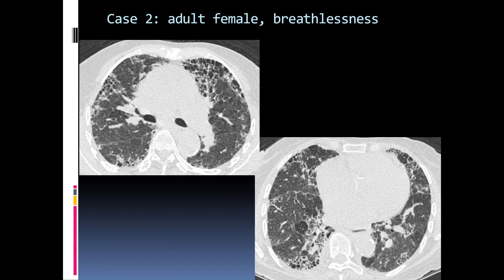This is an HRCT showing two predominant abnormalities: one is macrocystic honeycombing and the other is reticulation or reticular opacities, noted bilaterally with a peripheral predominance. There is also peripheral architectural distortion and loss of volume in bilateral lungs. So this is a case of interstitial lung disease of usual interstitial pneumonia pattern.